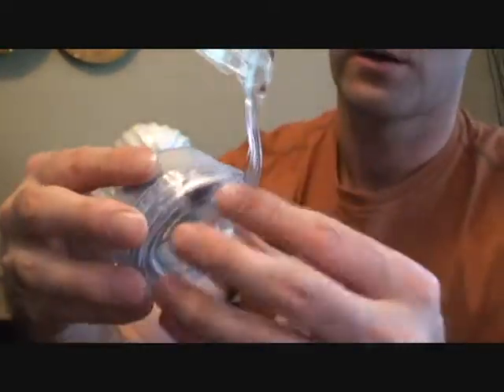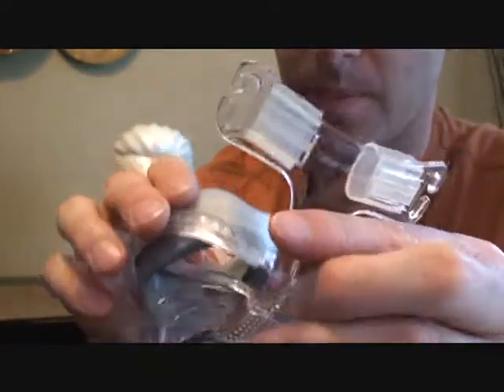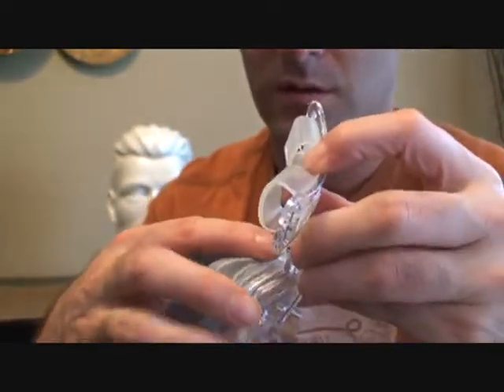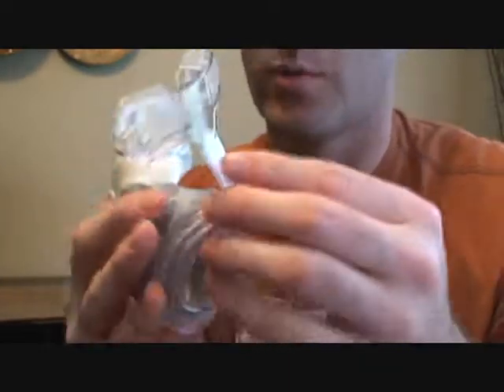Then you just slide this back on. There's like a notch right here at the top. That part fits in with the notch here. And then it should clip on. You hear an audible snap.